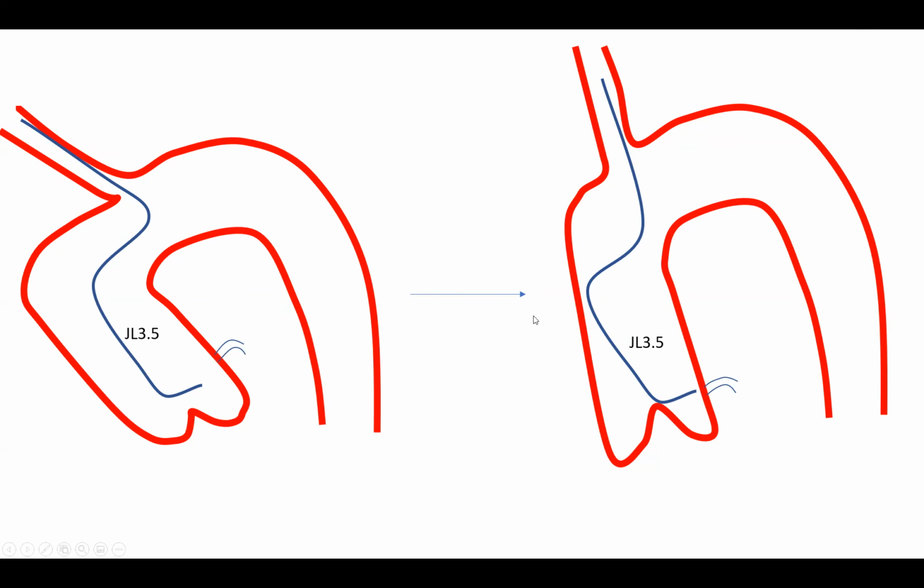So deep breath can help you engage the catheter in cases where that catheter seems to be pointing too much down. Alternatively, in this patient, you could have pulled with a slight clock to engage. You could have tried to push and engage from below, or you could have got Judkins left 3 to engage. But deep breath is another technique in your arsenal. Okay.